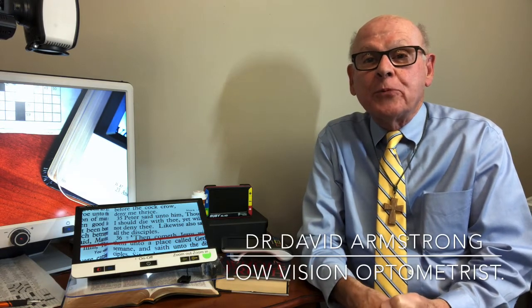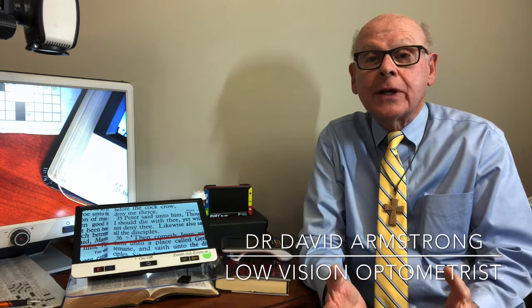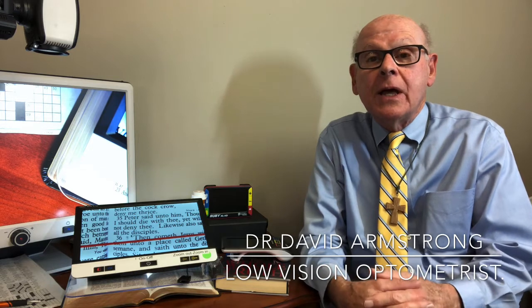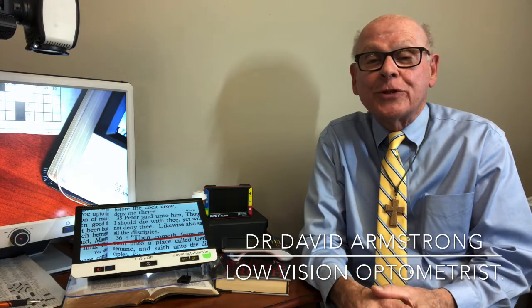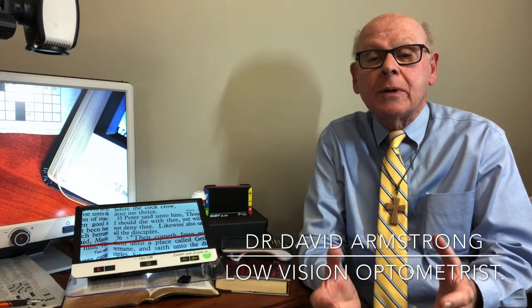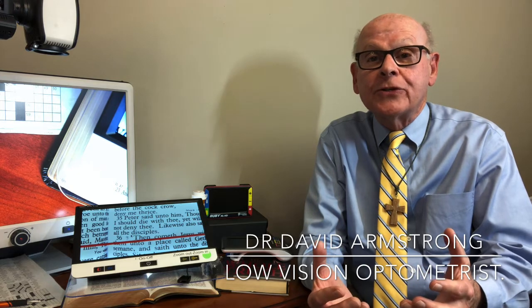I think you can see that there are a number of excellent options for helping people with low vision read by using electronic video magnification of various types. The job of the low vision optometrist is to determine which particular device is going to work best to suit the needs of that individual patient.